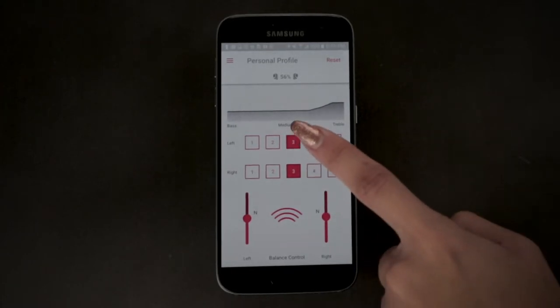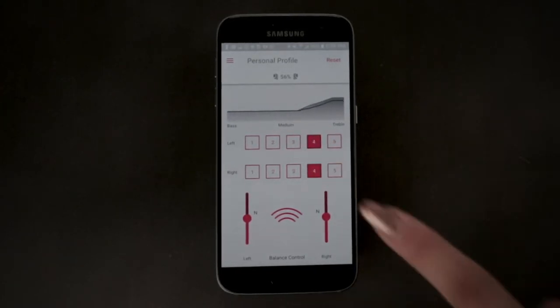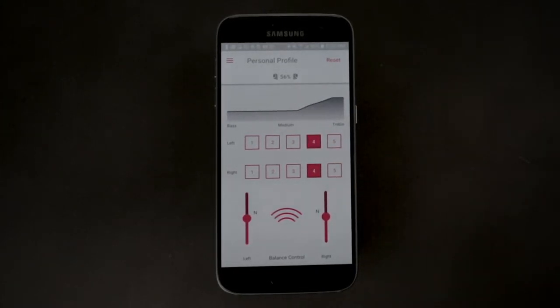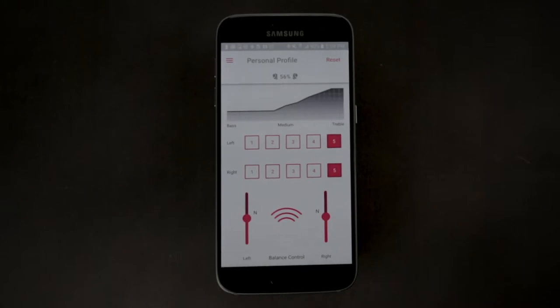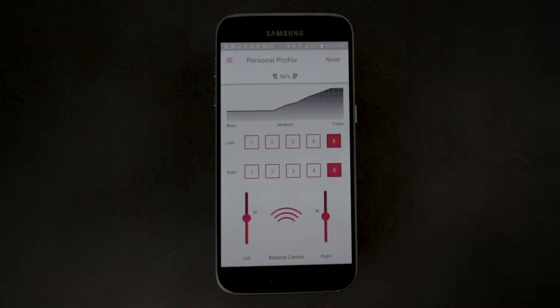Four and five are stronger treble or high frequency boosts. If you have trouble hearing female or children's voices, it's recommended you experiment with setting four or five to choose the level that gives the most clarity while listening in a quiet environment.